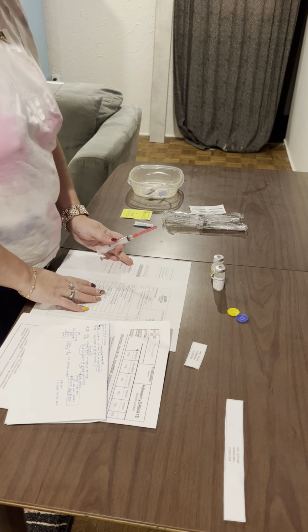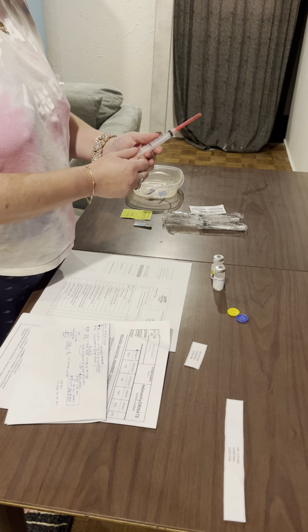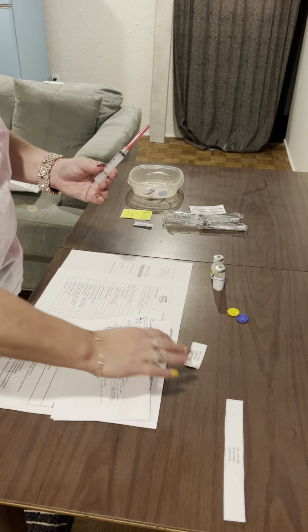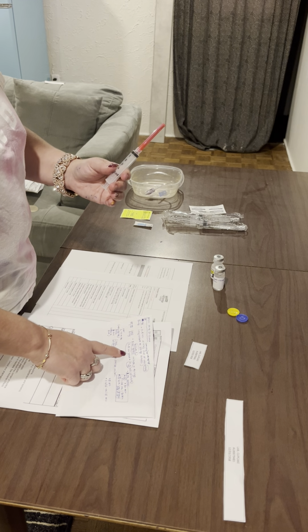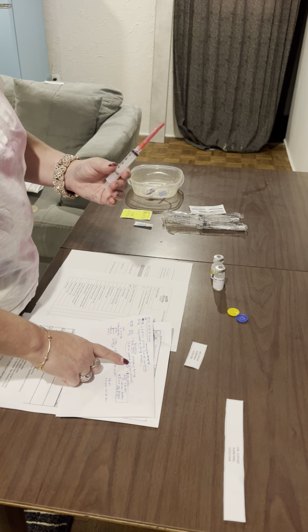Okay, so the first thing we're going to do is draw back air of 4.5 milliliters. And again, we'll check our med math and make sure. So the first thing we're doing is the diluent first.